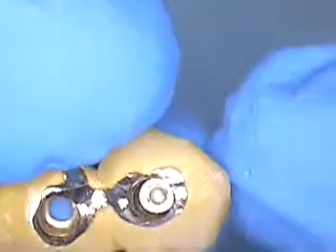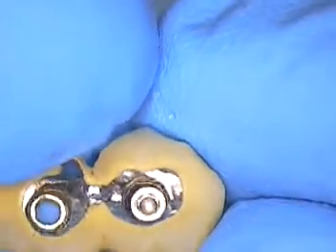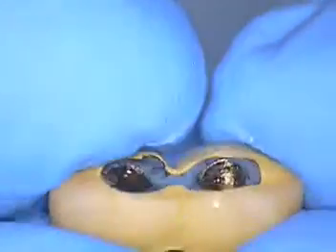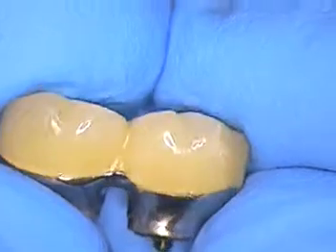I've already placed a prosthetic screw in the implant position of number 20, and 19 is out right now. So we're looking at the side of the bridge. Now I'm going to just show you the part number.